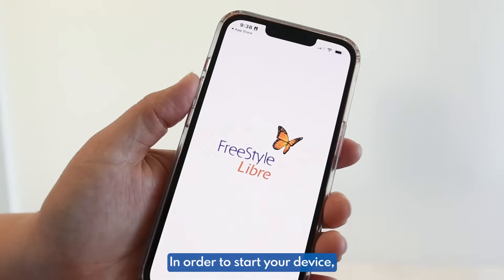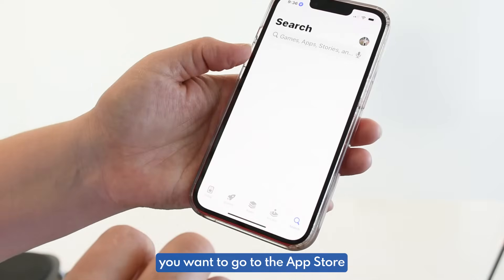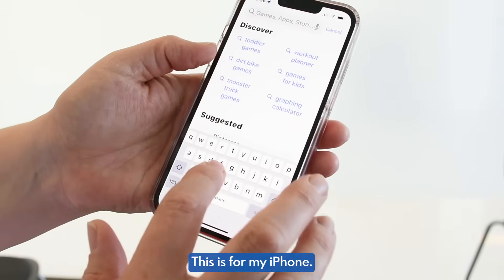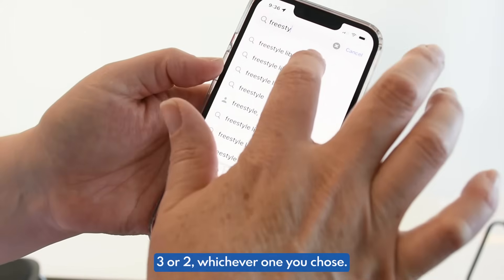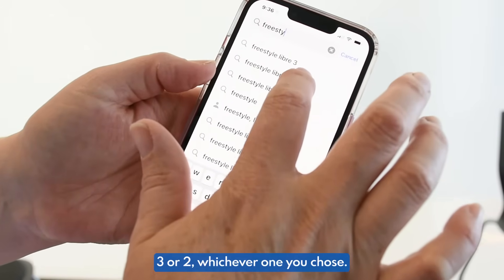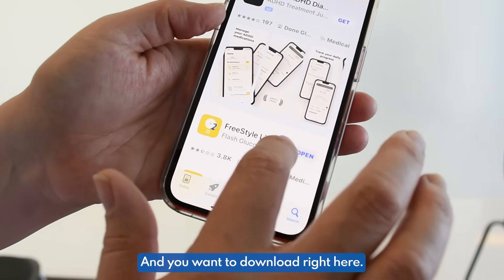In order to start your device, you want to go to the App Store and search — this is for iPhone. You want to search Freestyle Libre 3 or 2, whichever one you chose. I have the Libre 2 on my arm. And you want to download it right here.